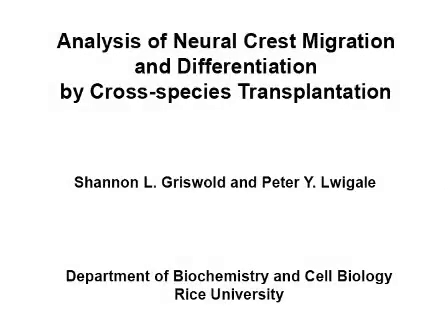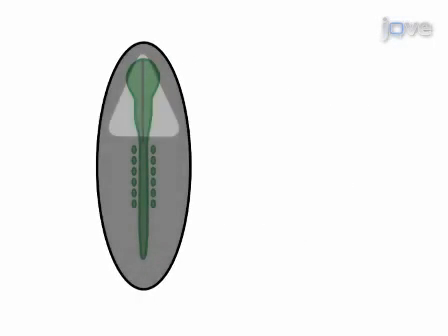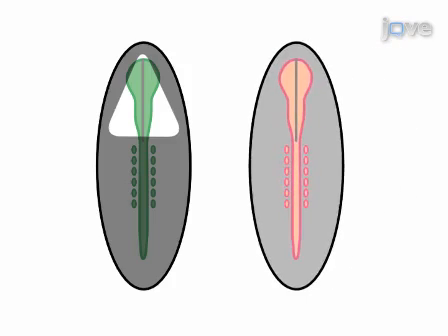The overall aim of this procedure is to graft a dorsal neural tube explant from a quail embryo into a staged matched chicken embryo, so as to trace the migration and fate of neural crest cells. This is accomplished by first tearing a small hole in the host chicken embryo's vitelline membrane to access the neural tube. The donor quail embryo is then removed from its egg to prepare it for graft excision.